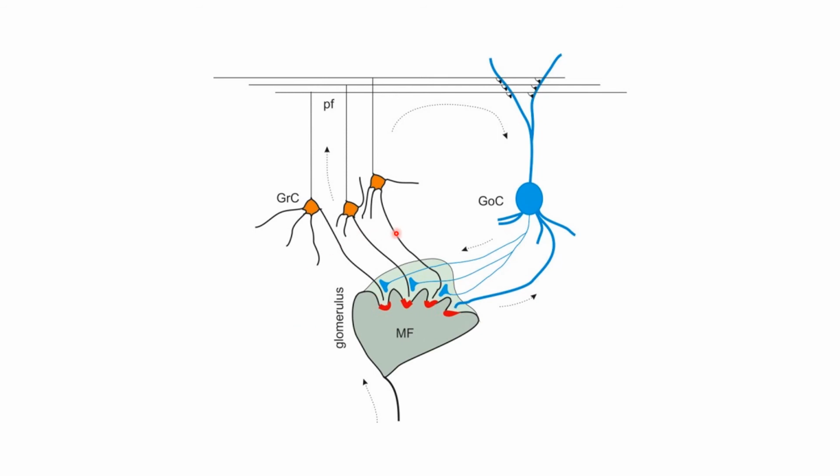There are nuclei present in these different layers, but you will be seeing some islands of clear areas in between. These are called glomeruli, which are formed by the processes of the granule cells, the axons of the Golgi cells, and these mossy fiber endings in dilatations or dilated projections.